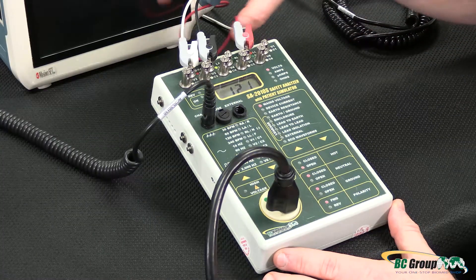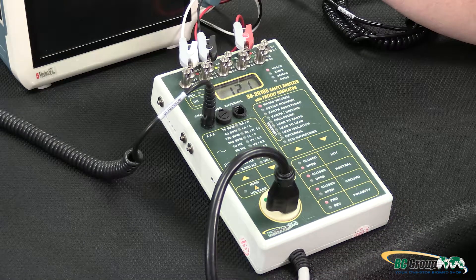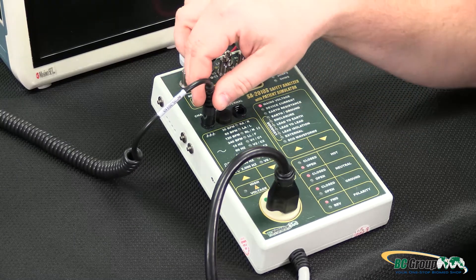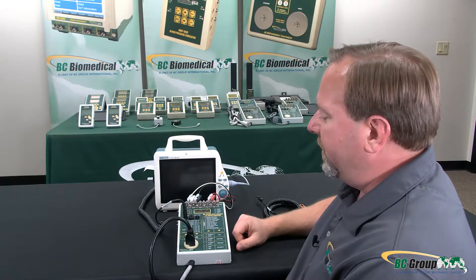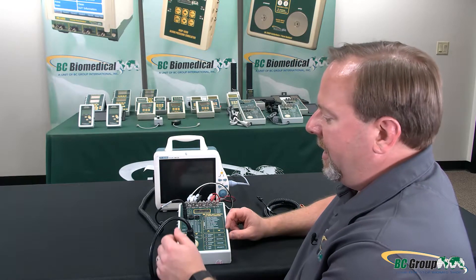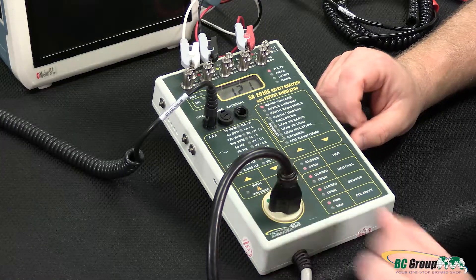I already have my ECG leads connected to my device under test — in this case a patient monitor, the PM8000 from Mindray — and I have a chassis cable plugged into the ground terminal on the back of the device under test. The safety analyzer is plugged into a standard wall outlet, and the device under test is plugged into the safety analyzer.